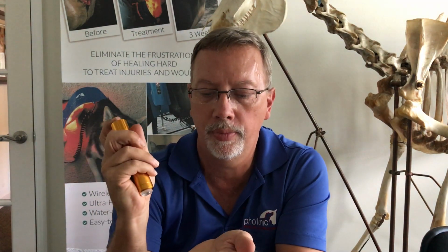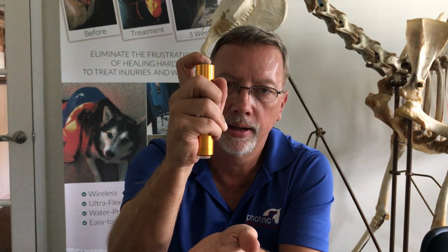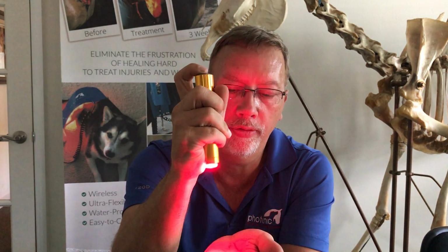Now this is set up where I changed the battery and it went back to being high, low. So now if I want to go back to just being low, high, which is the way I recommend to use it because it's less energy you have to use, plus it doesn't produce as much heat, just put it on low, push down on the top and hold for 15 seconds. You'll see it double flash. Now it's going to go low, high, and then you're set, and you still should have the frequency.